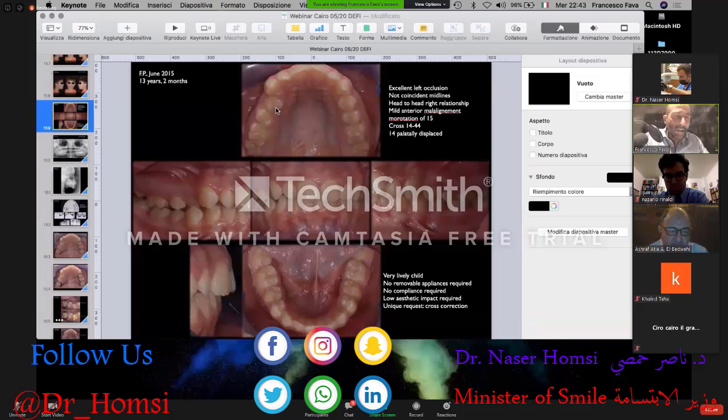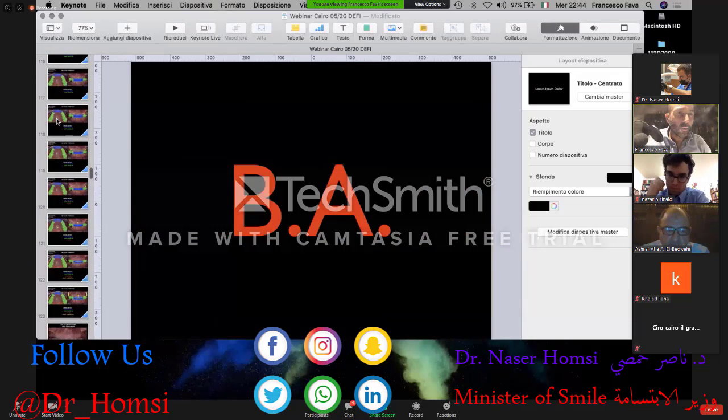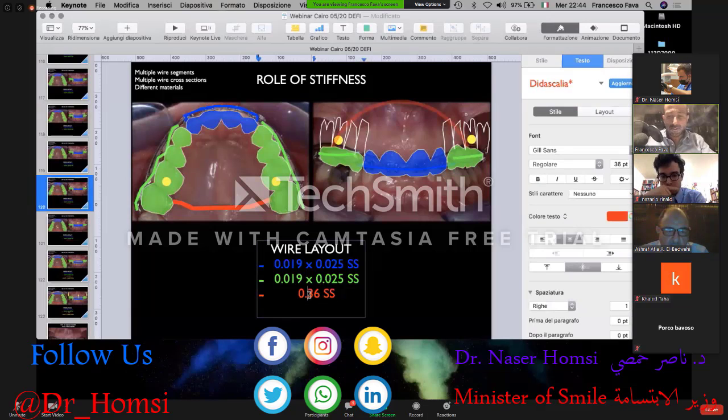The first option is the 0.036 stainless steel, which is very stiff. 0.036 for the transpalatal bar, which is 0.9 millimeters. It's very stiff and allows us to create a good anchorage because it's very stiff.